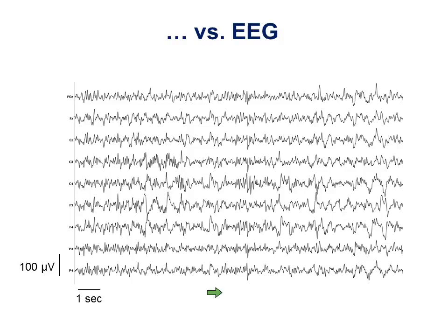recording, where again we're monitoring, in contrast to ECOG and spreading depolarizations, we're now looking at a very expanded, zoomed-in time scale of seconds, typically 10 to 30 seconds per page, so that we have sufficient detail to examine individual waveforms to look for epileptic spikes or theta rhythms or whatever it might be. And again, the amplitudes are typically in the range of hundreds of microvolts or less, which contrasts with events on the scale of 15 to 20 millivolts.